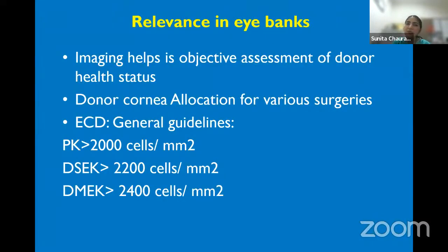The relevance of specular microscopy in eye banks is very important. It is a very important tool in the eye bank to assess the donor cornea allocation for various surgeries. And these are the ECD guidelines which we follow for donor cornea selection.